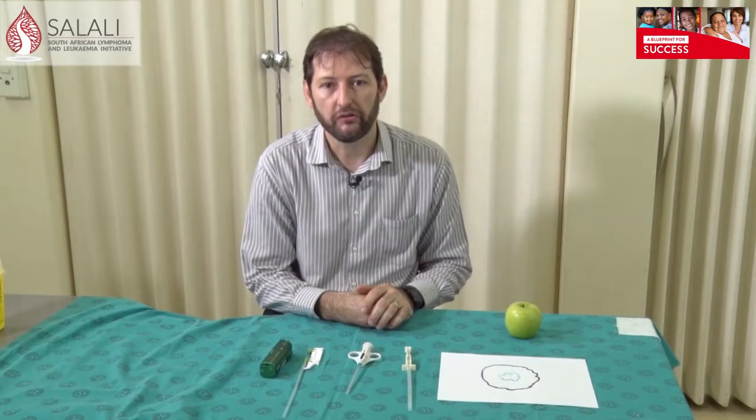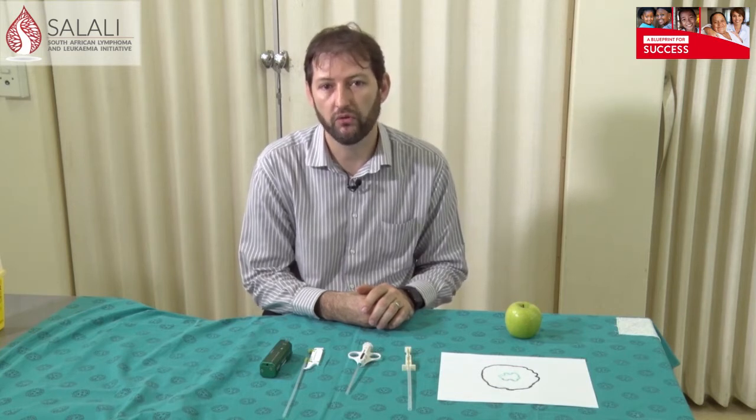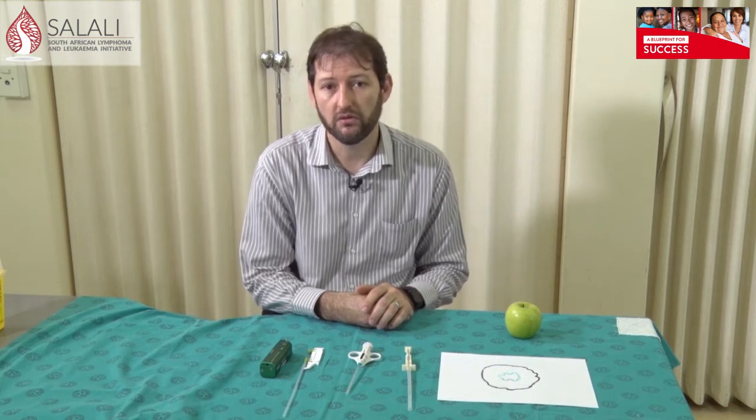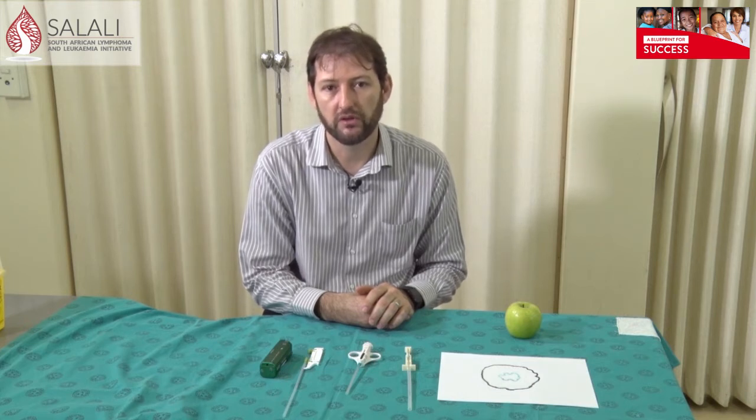I'm going to start off by showing you the different types of needles available to do core biopsies. Core biopsies are mainly used for histology. It's the main biopsy we use and it's the gold standard around the world to obtain tissue biopsies for most soft tissue tumors as well as breast tumors.